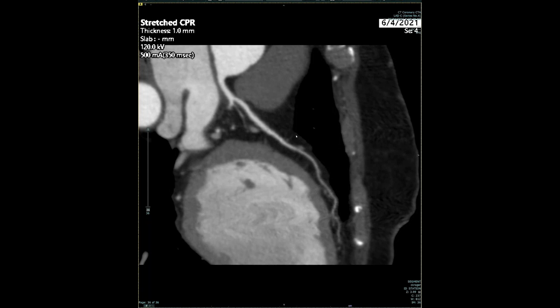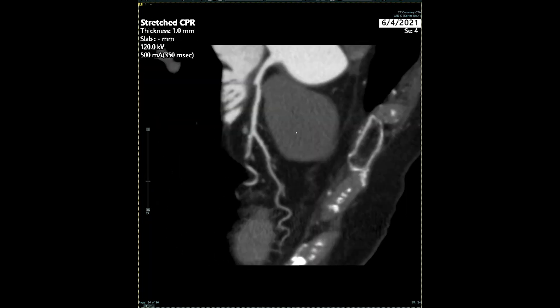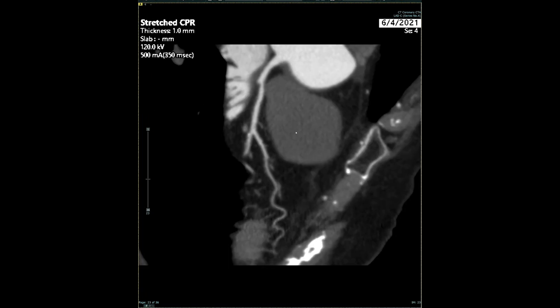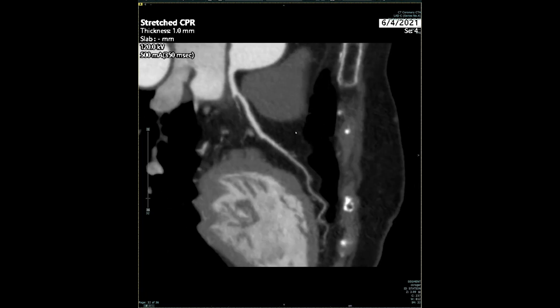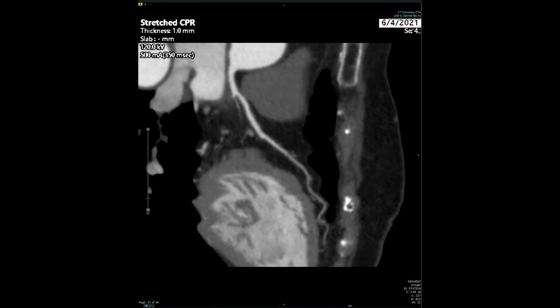The plaque does not cause a significant degree of narrowing or stenosis. The vessel is open and otherwise OK. This would not cause the patient to have any symptoms of angina or chest pain with exertion.